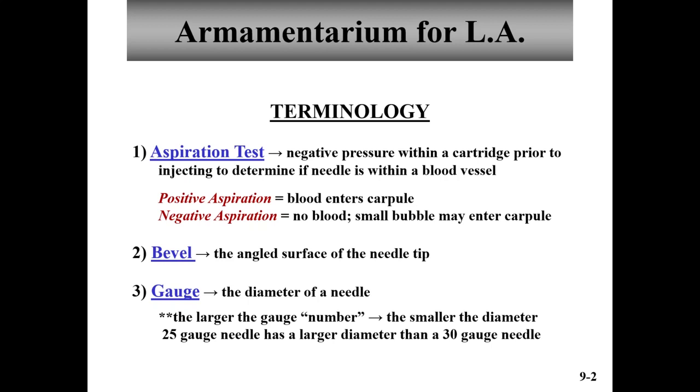The bevel's really important because you want to make sure that you line the bevel up in certain positions based on the type of injection you're giving. And we'll talk about that as we go through the technique for each individual injection. But you need to understand that the bevel is going to be the flat surface of the needle.